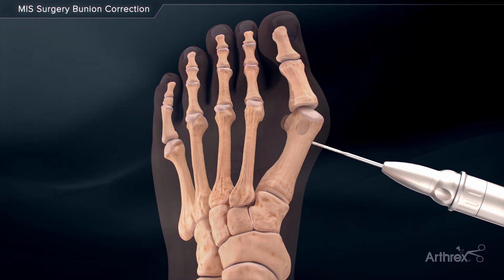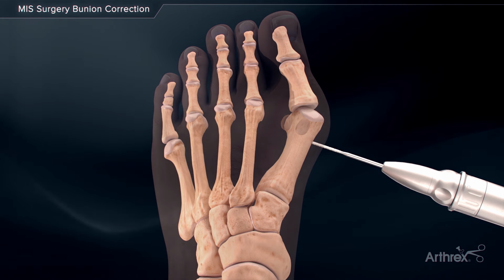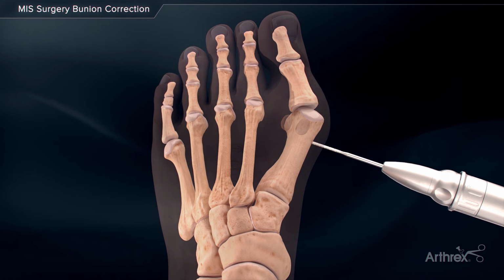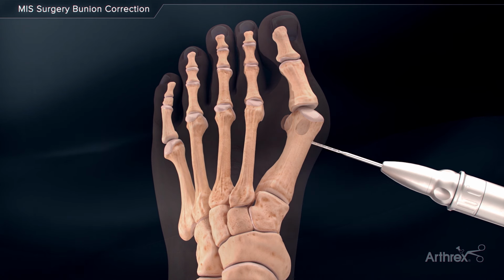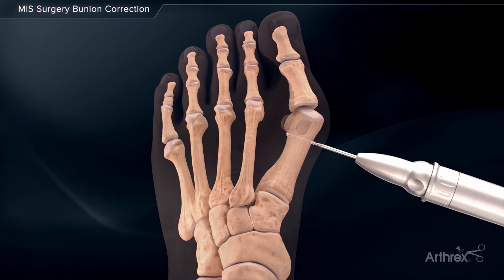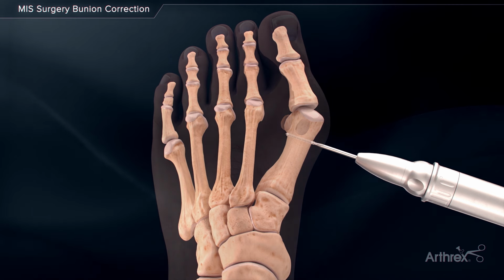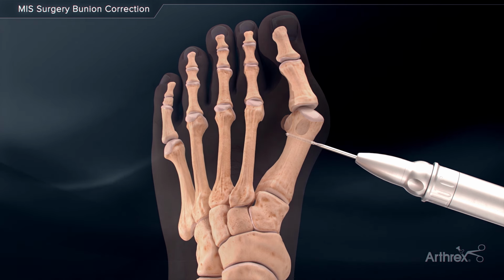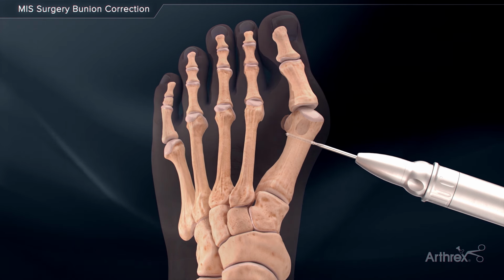the periosteal elevator. The 2 mm by 19 mm burr is introduced proximally to the sesamoid complex, midline at the metatarsal, and advanced to puncture both the medial and lateral cortex of the metatarsal. It is important to note the initial trajectory of the MIS burr to ensure the surgeon accounts for maintaining, lengthening, or shortening the metatarsal based on the angle of the burr.